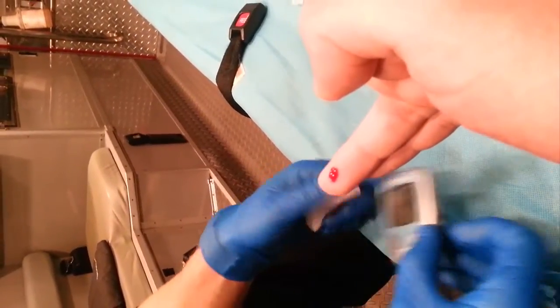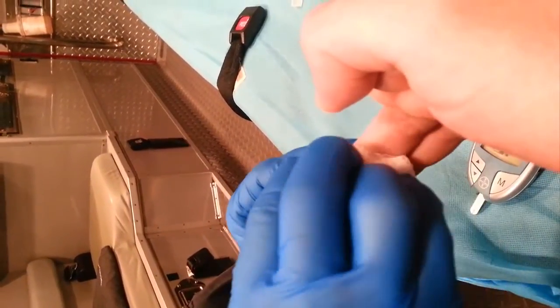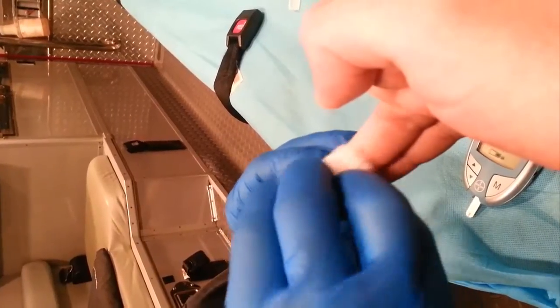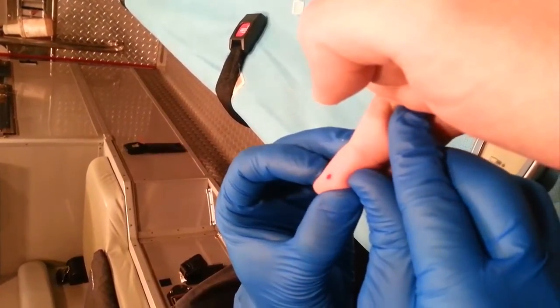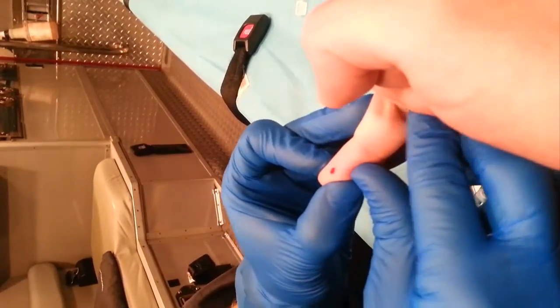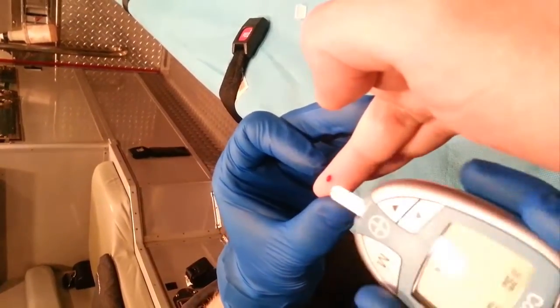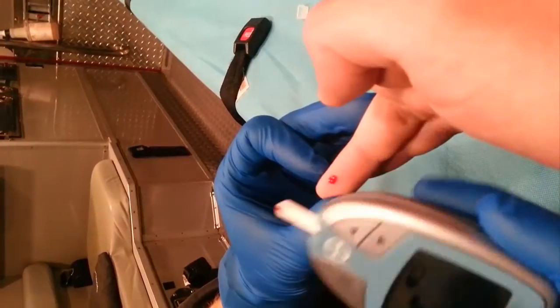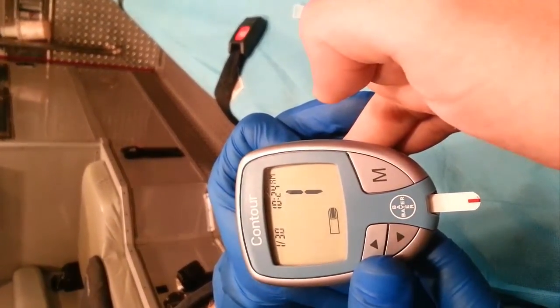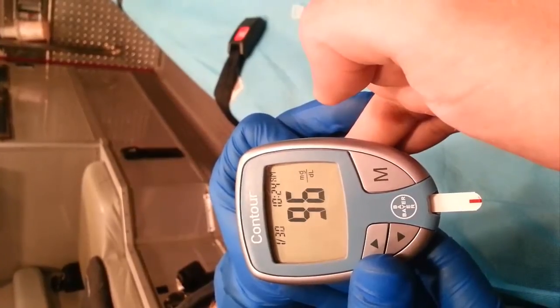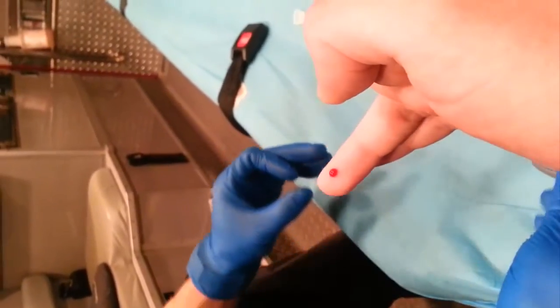So putting a new strip in. Swabs away the contaminated blood. All right, now we have another sample. All right, let's see what we get this time. 96. So we had a pretty big difference.